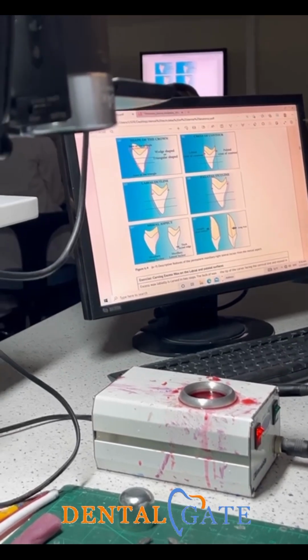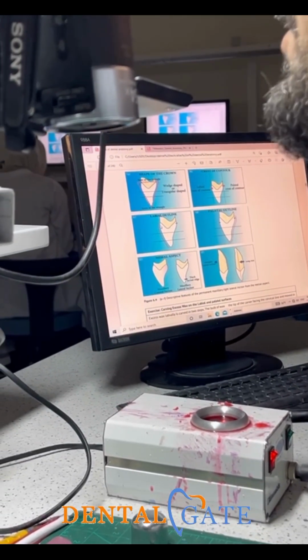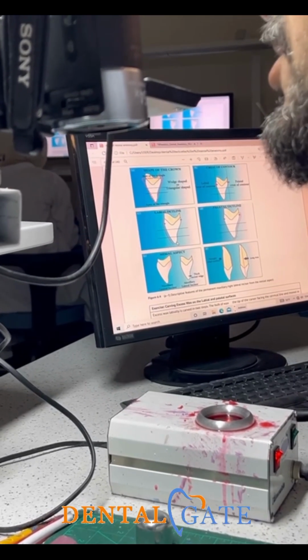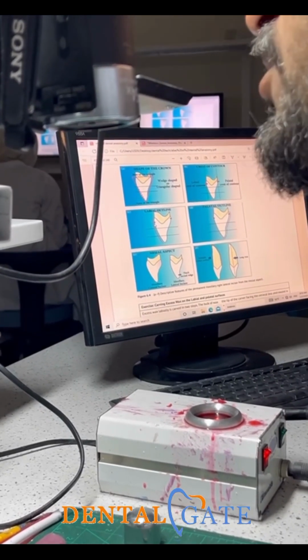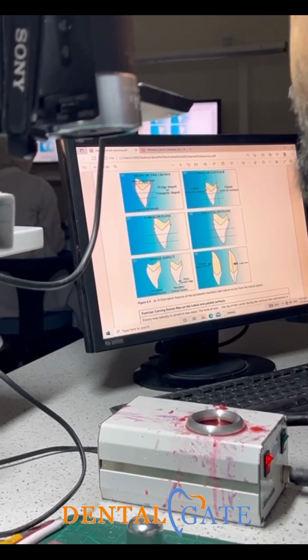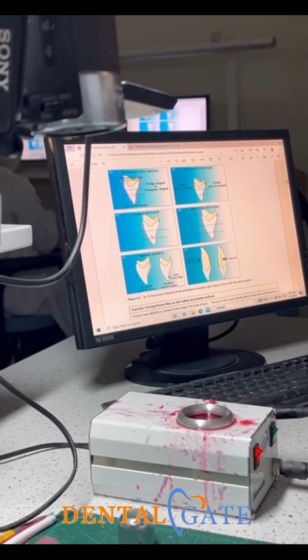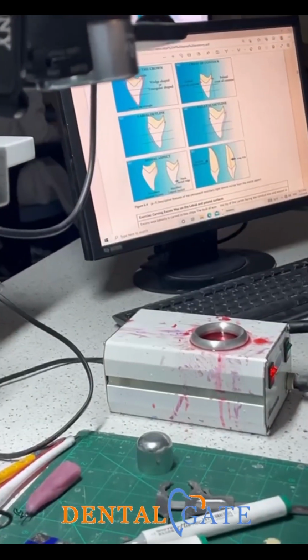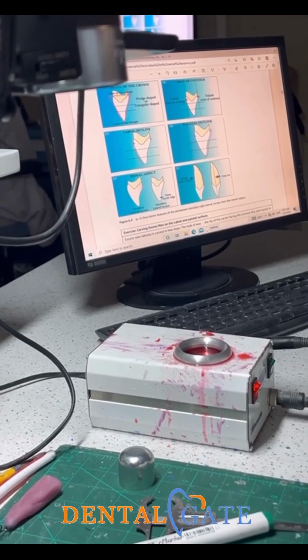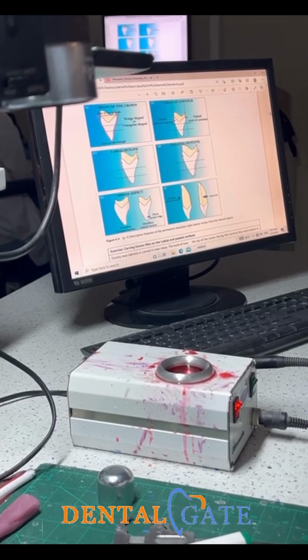What I need now, I need to make a curve. This is a 5, this is a 6 millimeter, and I alter my inclination toward the incisal dot, okay? Within a curvature here. I will construct a curvature here. I will transfer this shape, okay? I will transfer the shape from the labial. You can see I will make these aspects.